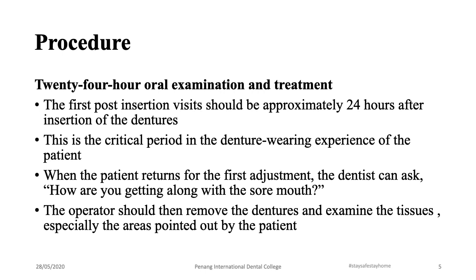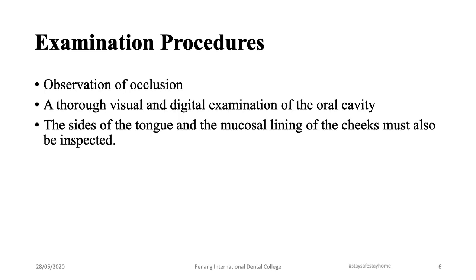And once you rectify, you give it back to the patient and you ask him to try it out. So that should actually solve it. If it doesn't solve, then you might have to recall him again in the later stages. So examination. After you have listened to what complaint he has given, you have to examine.